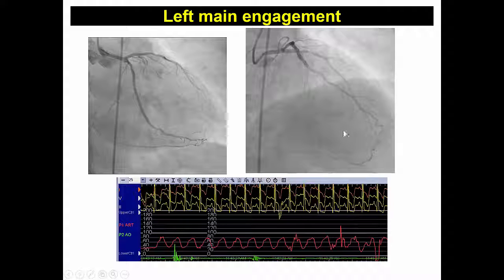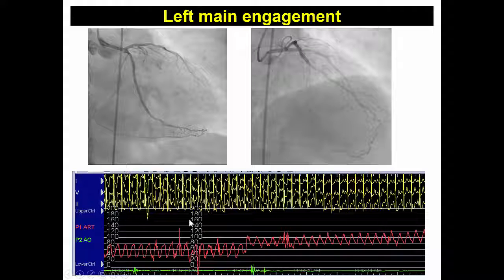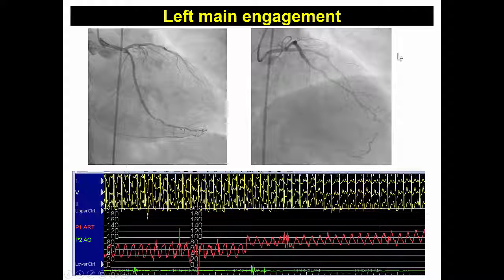When the patient came to our lab, the first thing we wanted to do is to assess that the left main was indeed non-significant. However, upon engagement just with the 6 French guide, we saw severe dampening of the pressure. We had to move the guide way back and then there was normalization of the pressure. That is highly suspected of the patient having significant ostial left main disease.